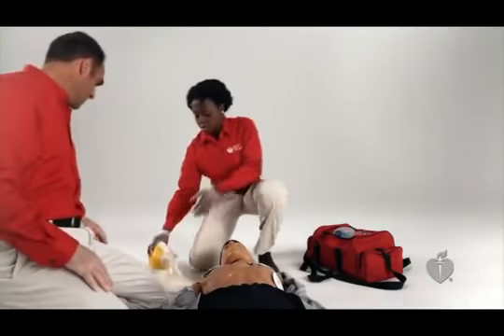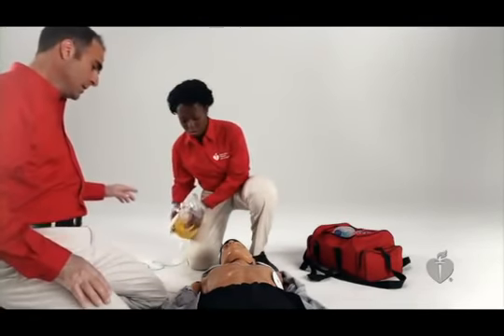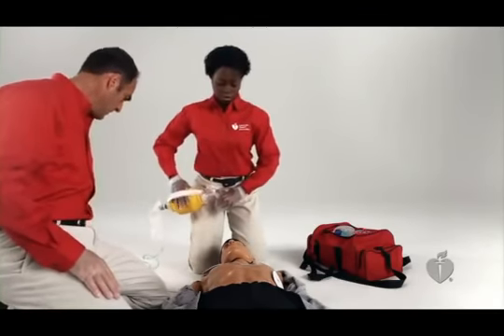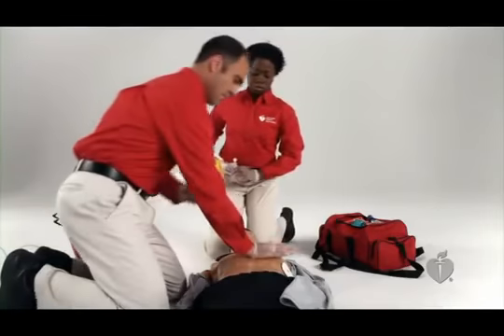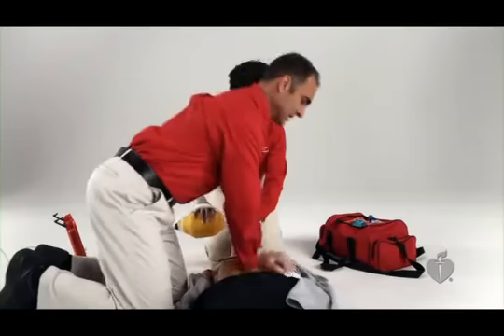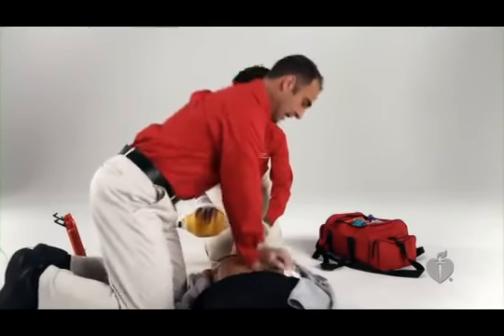Then loudly state a clear the victim message. It can be something like, "Everybody's clear," or simply, "Clear." Perform a visual check to ensure that no one is in contact with the victim. Shock advised. Clear. Press the shock button. The shock may produce a sudden contraction of the victim's muscles. As soon as the AED gives the shock, immediately resume CPR, beginning with chest compressions.